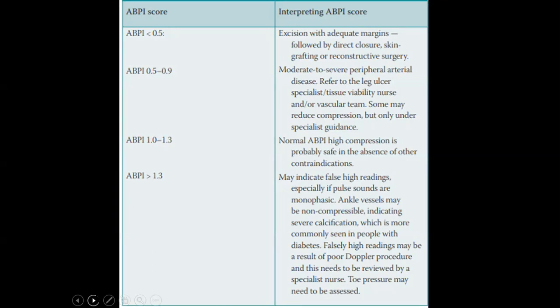So you have to look at these scores. An ABI, anything less than 0.5 is essentially terrible occlusion disease, all the way up to our OK or our moderate PVDs, our normal ABIs, and then our falsely normal ABIs. So that's the other reason we need to look at these waveforms, which I'm gonna go to in a second, is these false negatives, these patients who have decent looking ABIs, but their arterial calcifications are giving us false reads on these.